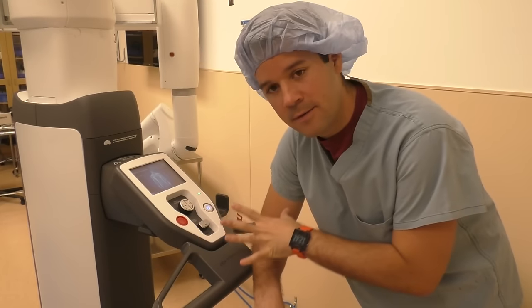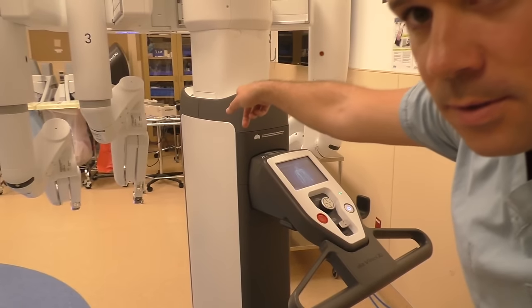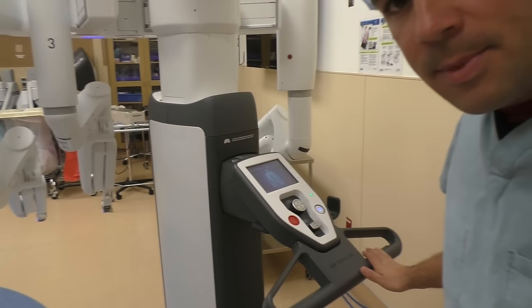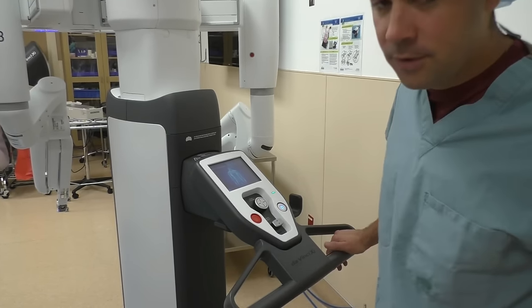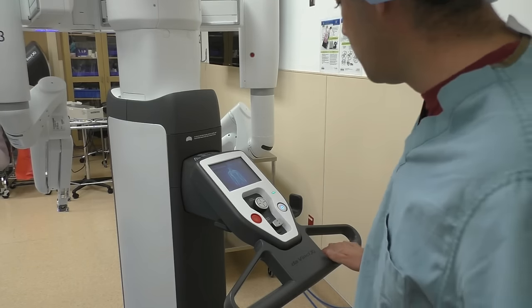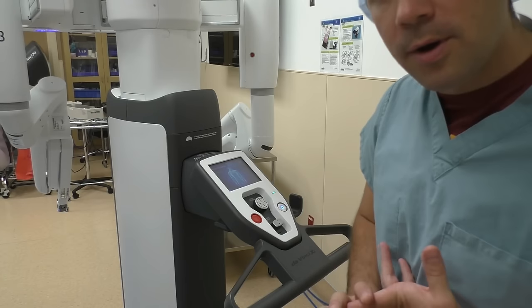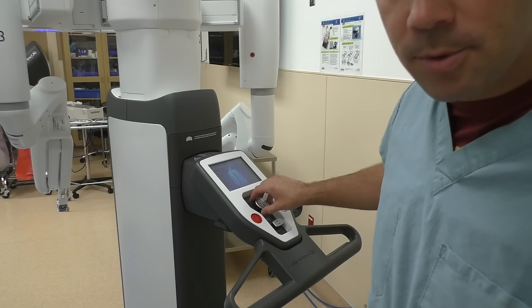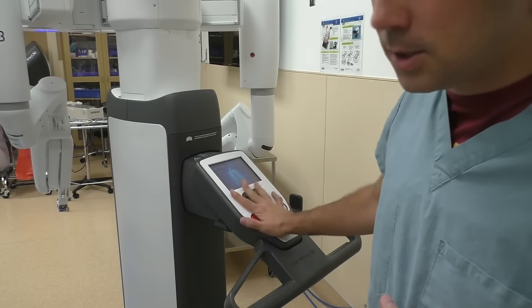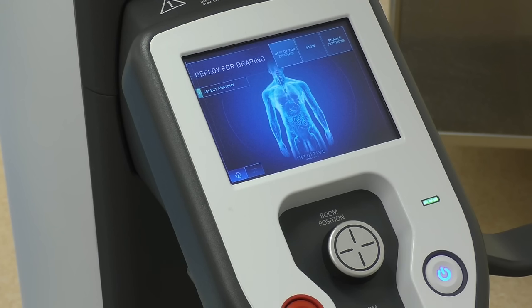Now this is the back part of the actual robot itself. You can see the arms are over here — this is the back part, this is what you're going to use to drive the robot. If you are a nurse, you'll be driving the robot. To go over how to deploy for draping and how to move the boom and set up the boom, this is the console where you'll be doing all of that from when you first come in the room.